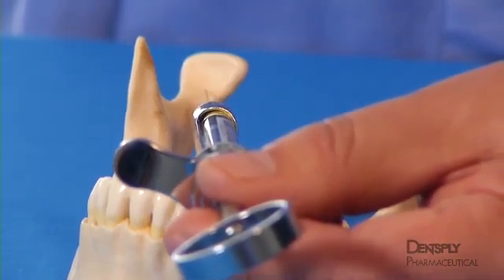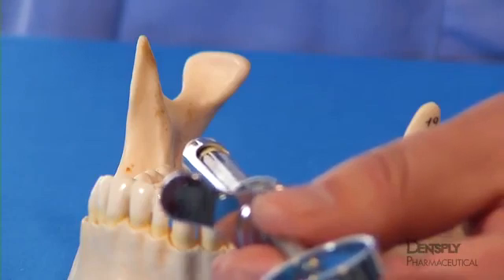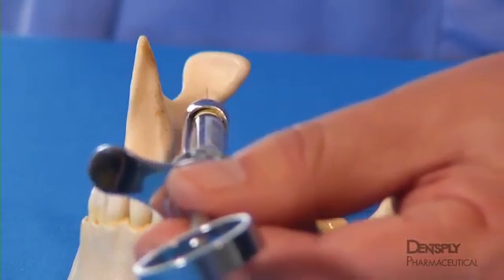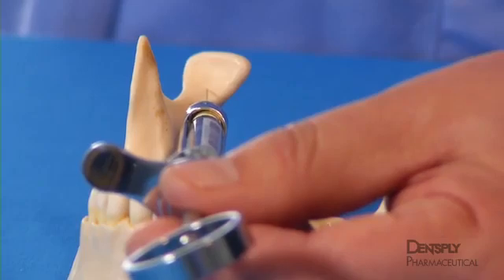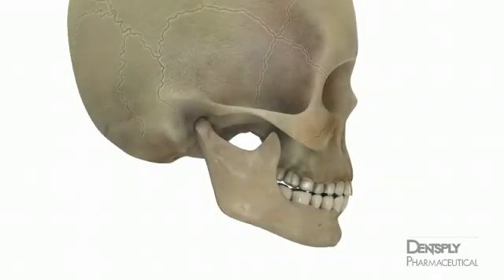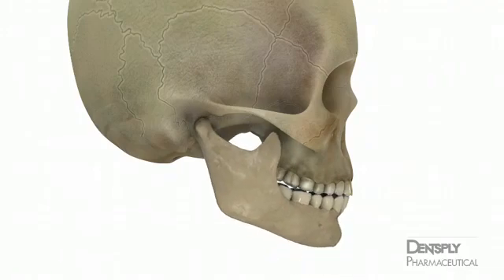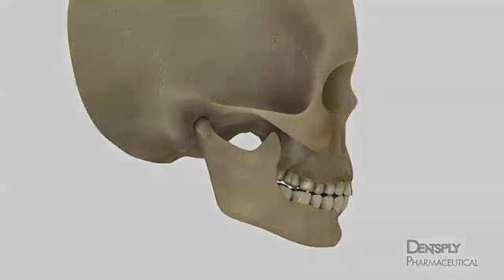For instance, if the insertion point is correct but bone is contacted prematurely, then the needle should be partially withdrawn and the barrel of the syringe moved mesially along the contralateral quadrant before reinserting the needle to the final depth. A second explanation for failure to contact bone is that the patient's mouth is not open sufficiently for the neck of the condyle to rotate downward and translate forward into the plane of insertion. If the patient cannot perform this task because of trismus, then the Gow-Gates block should not be attempted. Instead, the closed mouth technique may be considered.